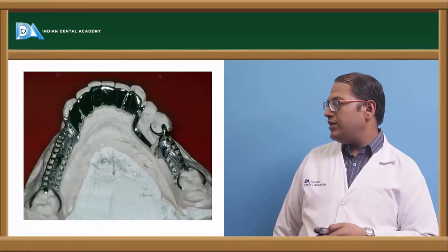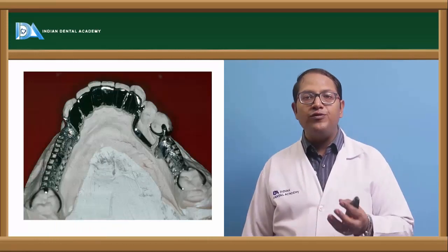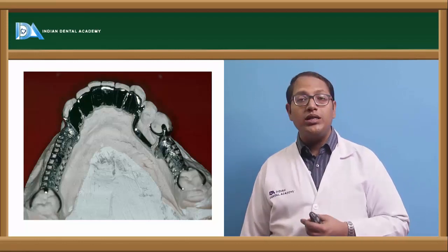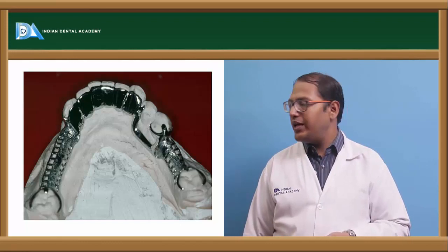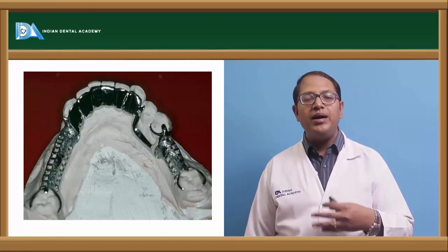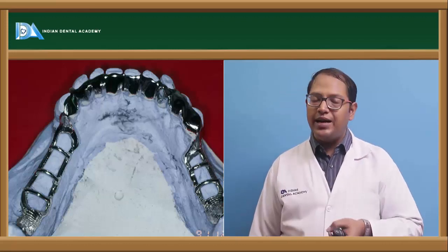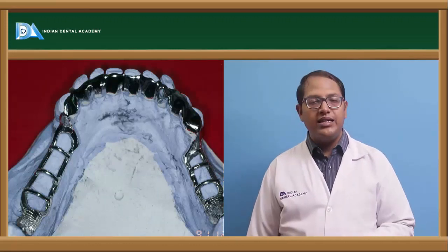Now how is this formed? These are formed based on the fabrication when we are working with the wax pattern. When it is a meshwork kind, we can see so many spaces in between the minor connectors. Whereas if you come to those of the lattice type like this, here we have large spaces kept in between one part of the minor connector and the next.